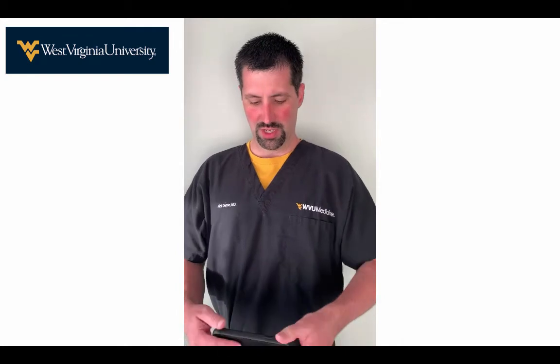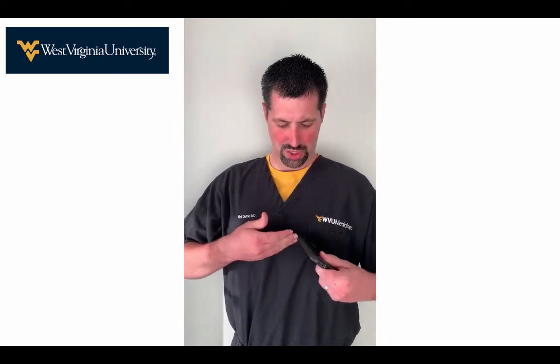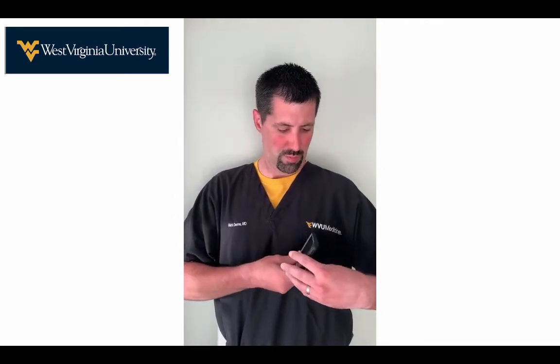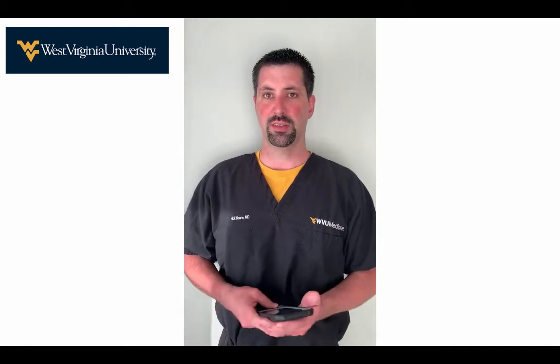So whenever you're looking for a parasternal long, here, let me use my cell phone. So pretend the on-off switch is the indicator. For parasternal long, you're going to be just to the left of the sternum with the indicator going toward the patient's right shoulder. Then you're going to rotate for a parasternal short. For apical 4, you're going to have your indicator up and in toward the axilla. And then down for the subxiphoid, I'm going to have you come down and have your indicator pointed to the patient's left. Does that make sense?